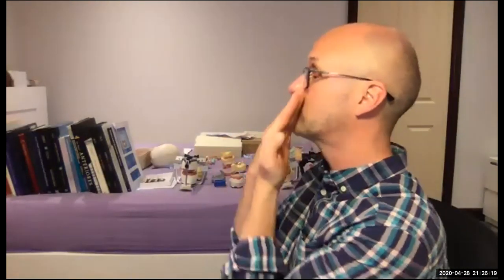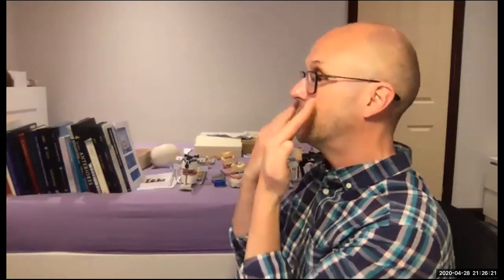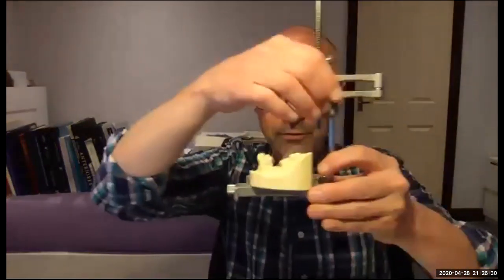So Anthony Coe, did you prepare guide planes on the mesial of the upper premolars, sorry, 1-4 and 2-4, to work with the posterior clasps? No, it was just that we have that path of insertion there. So I didn't need to do any prep on those anterior teeth. Sometimes I might have to. And again, I didn't do it for Wendy, but sometimes just using the surveyor, checking the path of insertion, and then we would adjust the teeth if need be. It's a good point.